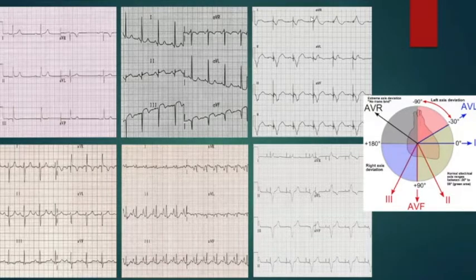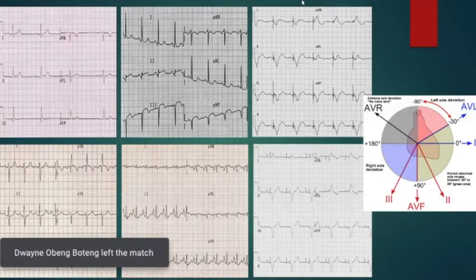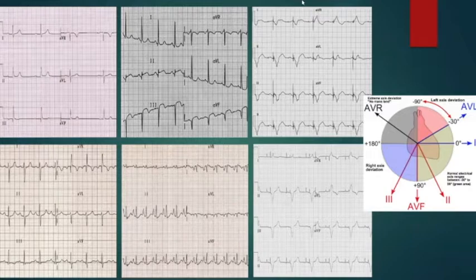Whenever you have a pacemaker, where is the pacemaker put? It depends how many leads you have. You are completely right, but I wasn't trying to mislead you. I was trying to explain why this is happening. There are several types of pacemaker. In our time, we are using mainly two, the VVI one and the DDD one.